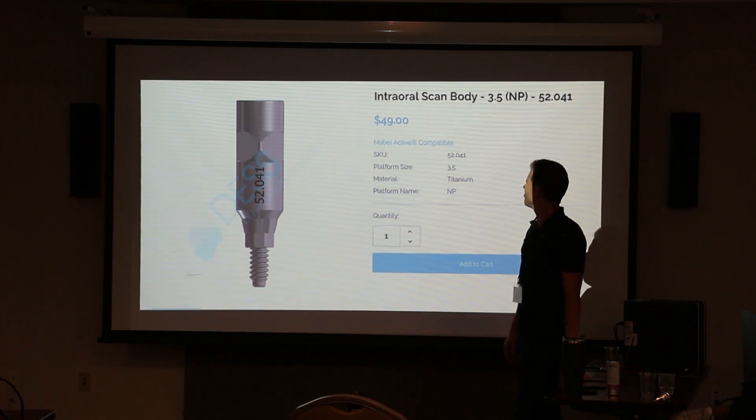I always thought that was interesting because I always thought they were milling out the connection at the same time — but usually the connection is already on there. This is Des's scan body. This is the scan body we use quite a bit; we like this one and we've used it a lot.